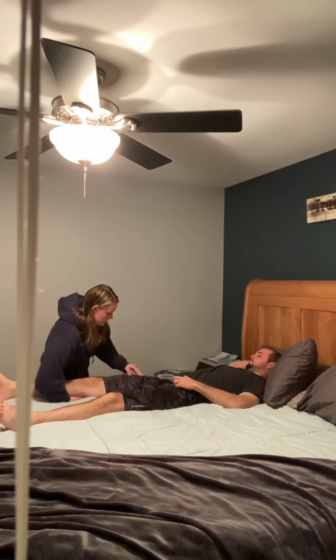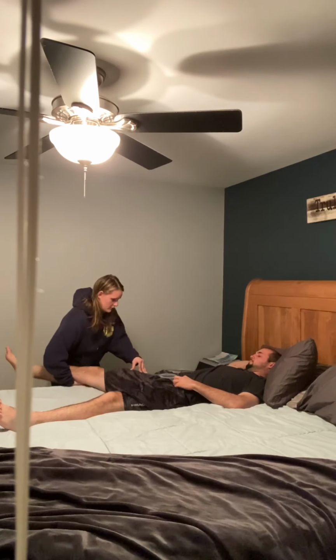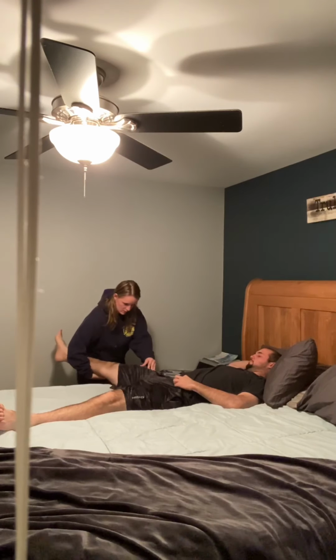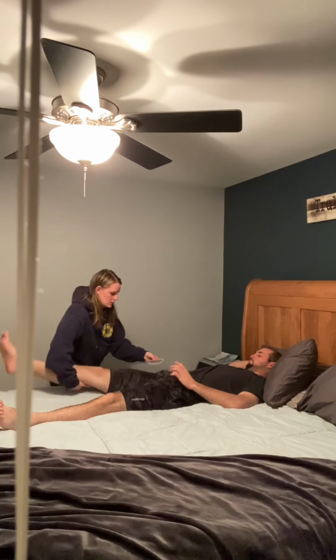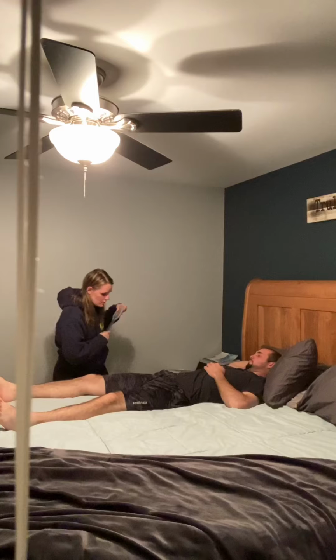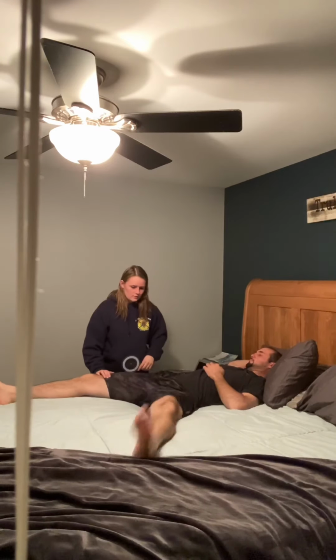You are going to take the patient's leg, making sure their pelvis doesn't move, and pull out into abduction. Beautiful. We're going to take this, put it down, it's meant for 90. We are at 48 degrees, and then to do hip adduction, wow, you're so good.